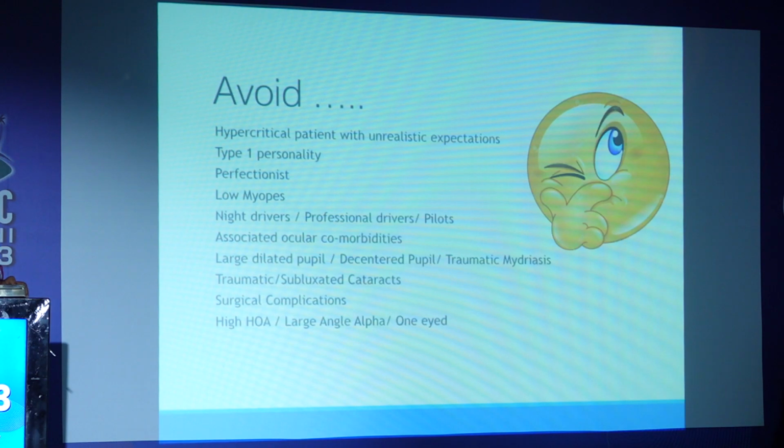For any kind of surgical complications that we have intraoperatively, I think we should not have any ego there, and we should always discuss with the patient on the table, and we should always have an alternative scenario. We've seen a lot of patients with lenses dislocated or not on the axis, and patients complaining of glare, vitreous in the anterior chamber. So I think this is a big no. If you have an open bag and the lens is getting decentered, the ego should not come in front, and these should not be taken on these kind of IOL platforms.